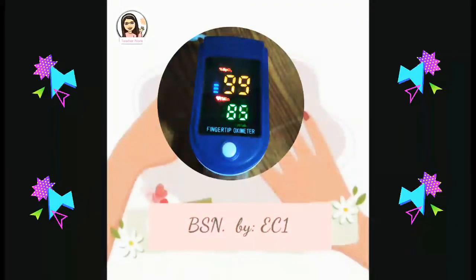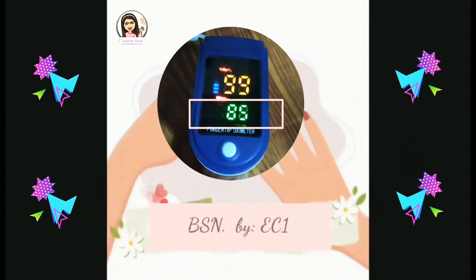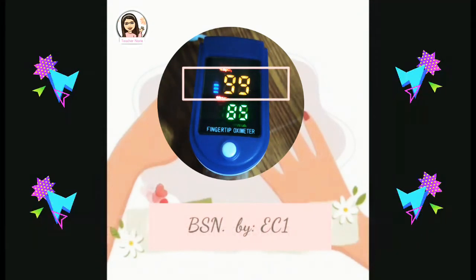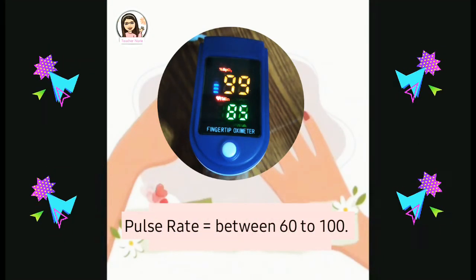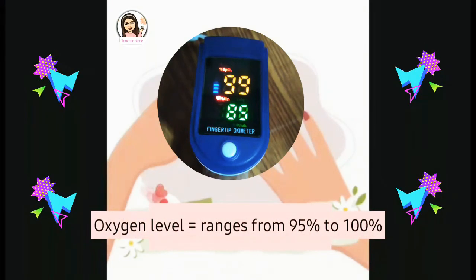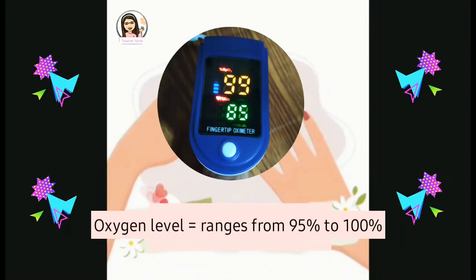It shows two important readings: the pulse rate, recorded as beats per minute, and the oxygen saturation of hemoglobin in arterial blood. The safe range of the pulse rate is said to be between 60 to 100, while the normal reading for the oxygen level ranges from 95% to 100%.